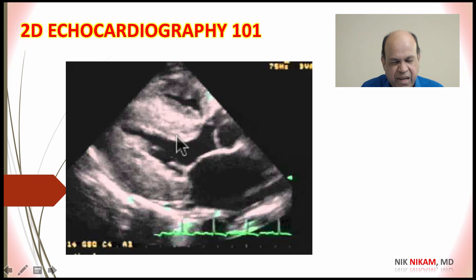There are various types of hypertrophic cardiomyopathy. In some places you have just septal, asymmetric septal hypertrophy compared to the posterior wall, but this looks like concentric left ventricular hypertrophy. And again, we can also see the aorta, the aortic leaflets, and the left atrium, which also appears to be enlarged. And this is the pericardium.